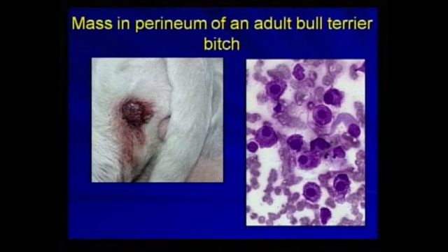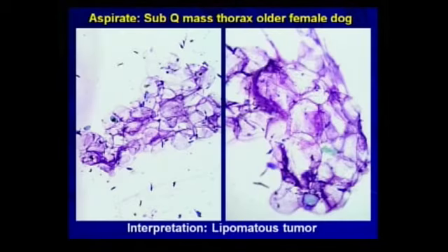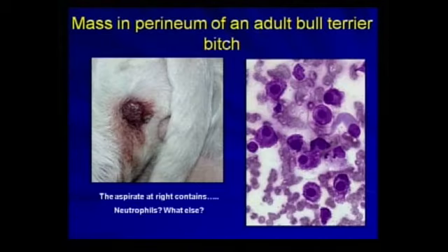Note that I do want to mention that the diagnosis here is lipomatous tumor. I would probably go with lipoma, but once again realize you can't always tell benign from malignant. Something like this is invariably benign in my experience.